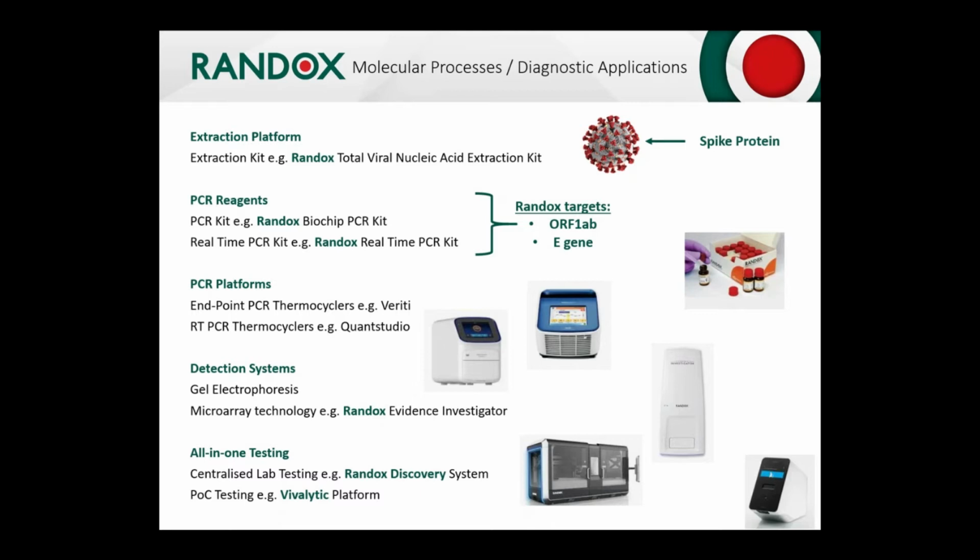Other manufacturers looked at the E gene and the S gene, and this is where the mutations really cause some issues for some assays. Some of the assays out there have looked at the S gene, and because of the mutations within the S gene, that's caused some issues with sensitivity. So you may find now that some laboratories that were using assays that looked at the S gene may have converted to a different assay, or they will ignore the result of that particular gene target. Or if a patient is positive only for the S gene, then that patient might either be rendered a negative, or might initiate a repeat of that patient's swab, or may request a new sample for that patient due to the issues of the S gene causing sensitivity issues for those assays.